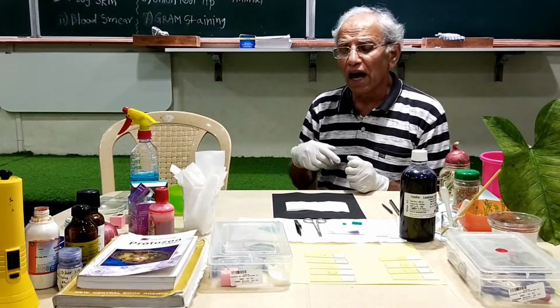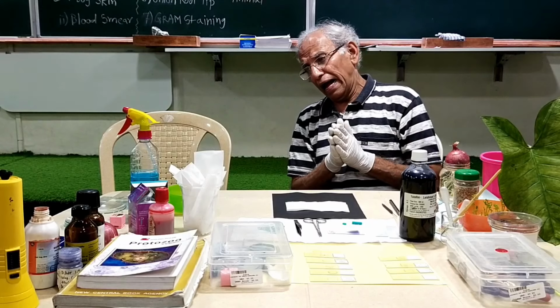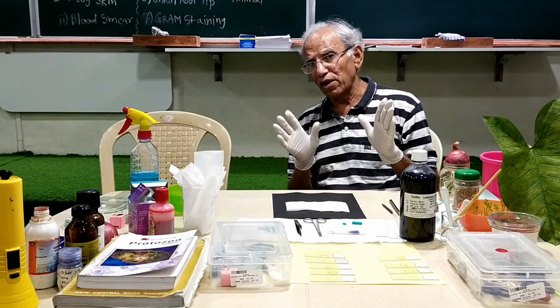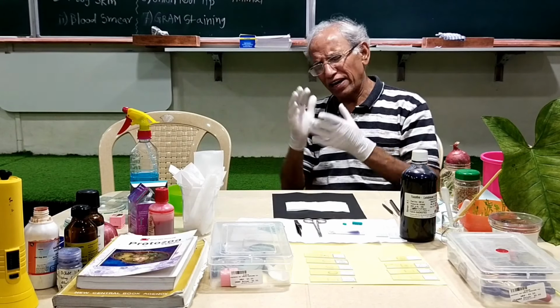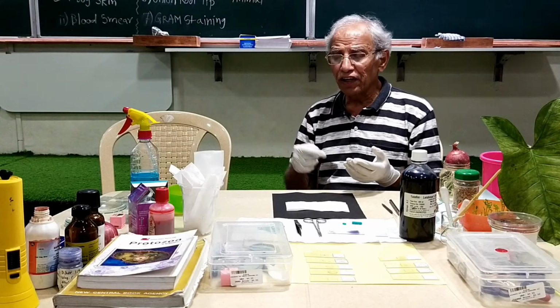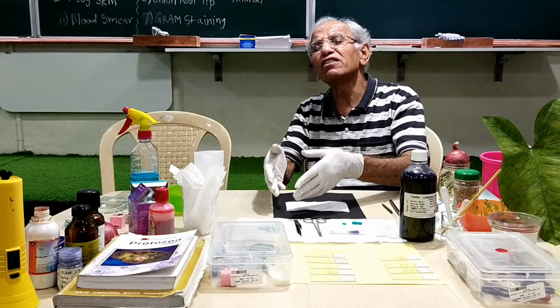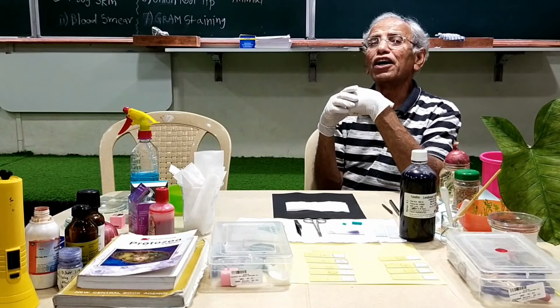He is bringing that. And meantime, let me tell you that it is very important to discard the needle. That's very important because earlier, in the old times, 25, 30, 40 years back, the same needle used to be used for many people. Not only for this kind of blood collection, also for any kind of injection.